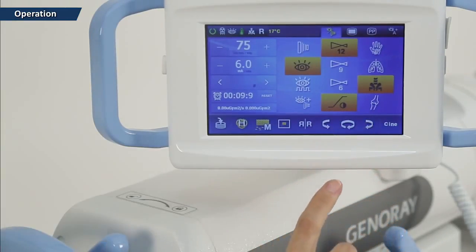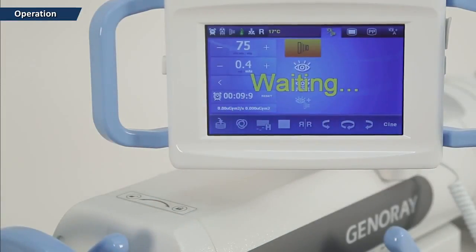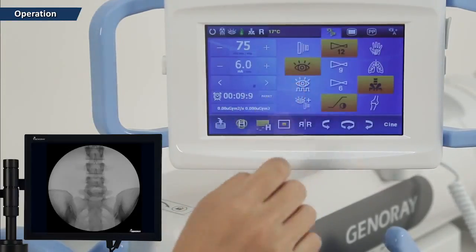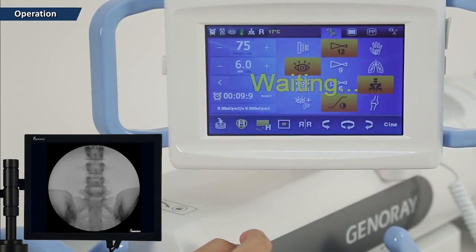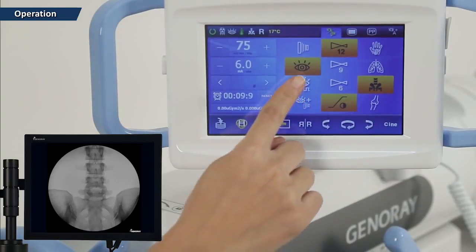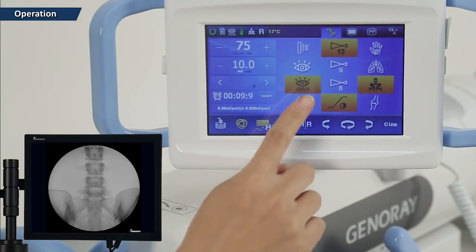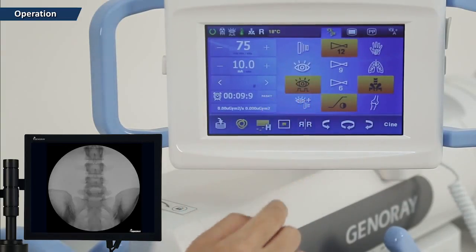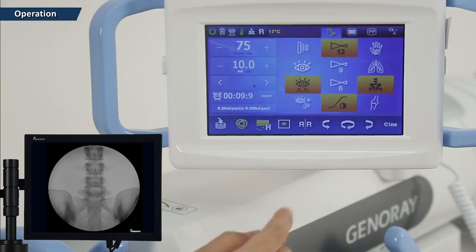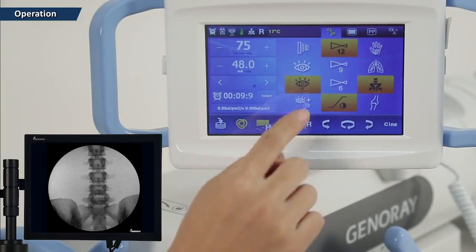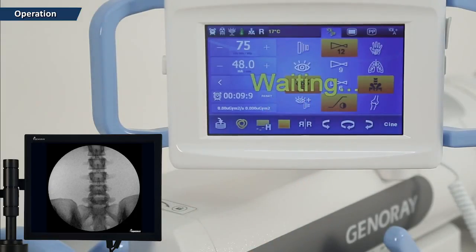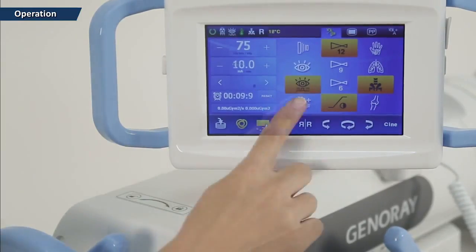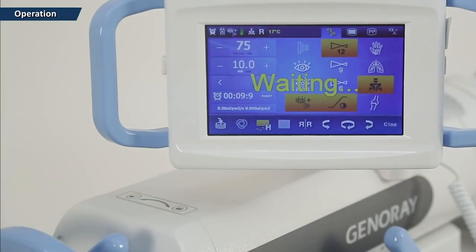The X-ray radiation mode has radiography mode, continuous fluoroscopy mode, 30 pulse fluoroscopy mode, 15 pulse fluoroscopy mode, 5 pulse fluoroscopy mode, and snapshot mode.